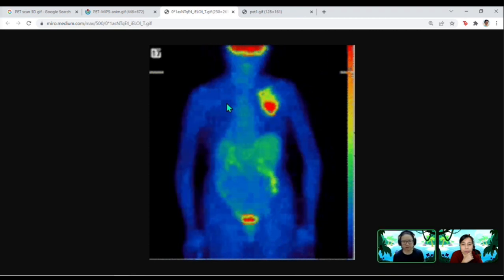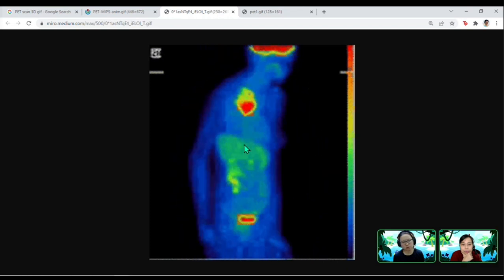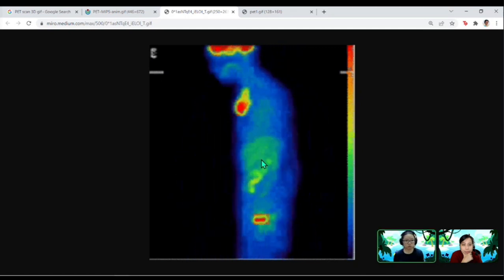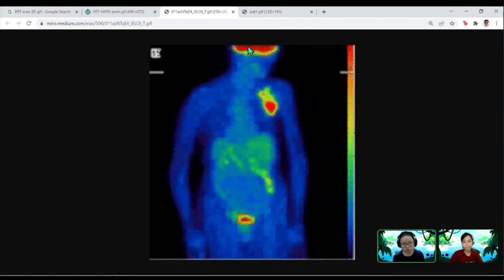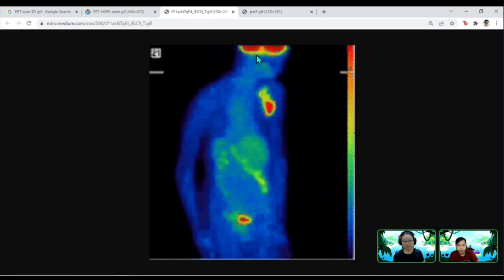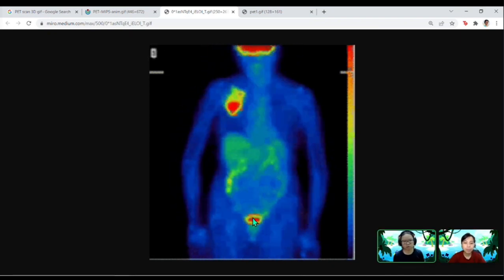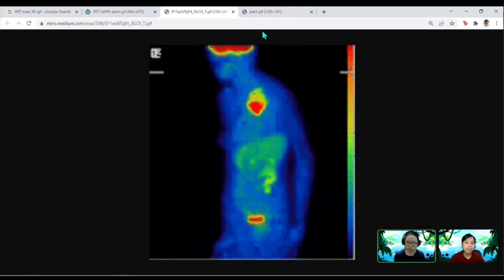And then you will be able to see that a lot of line of response is coming from this part. And the interesting thing is, you will also probably notice some colder responses around the body because the tracer is injected into you and actually travels throughout your body. You will notice that the brain is also very hot because we are thinking people. Whenever we are awake and conscious, our brain is very active. And you will also notice that the bladder is a bit full because we pee out a lot of the tracer. It won't stay in your body, as it should not.